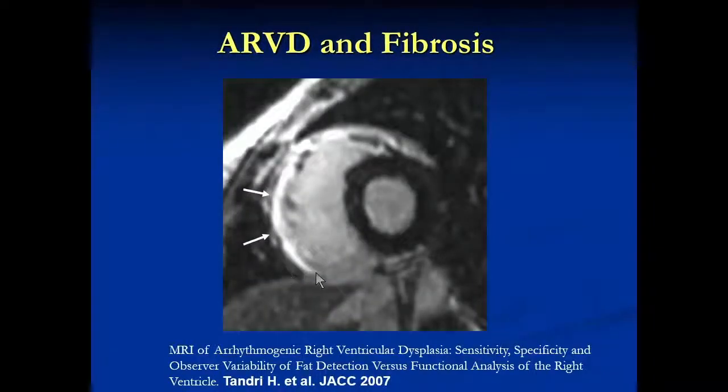Delayed enhancement is, again, powerful in ARVD because it's very specific, it's not very sensitive, and as I said, you will need other sources of diagnosis. Next slide, please.